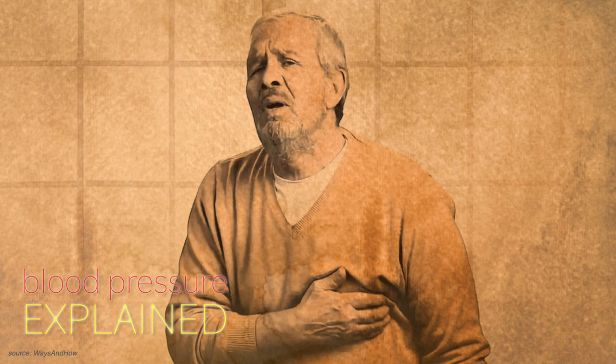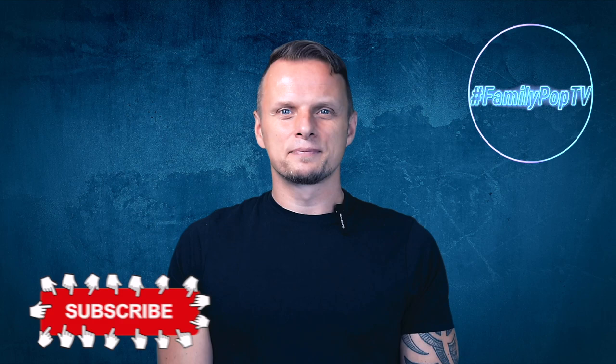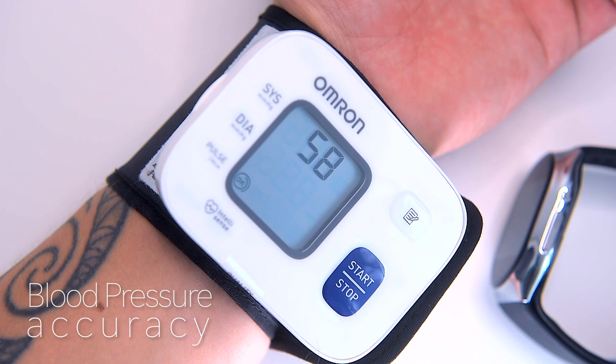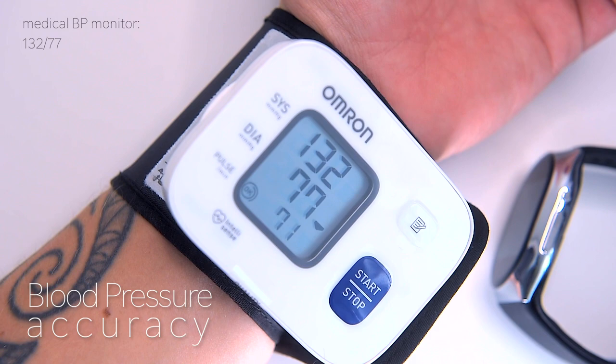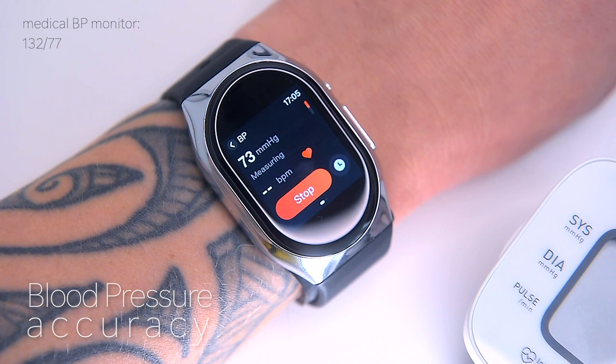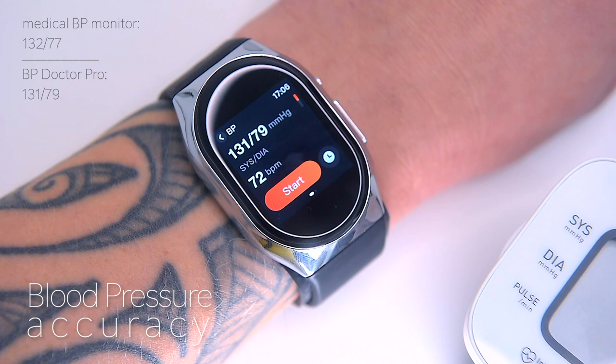Let's compare the readings from the watch against the OMRON blood pressure monitor. For reference I'm using an OMRON blood pressure monitor. During measurements I got my arm supported so my elbow is about heart level — obviously the cuff should be placed on bare skin, not over a shirt. Here we got 132 systolic and 77 diastolic on the OMRON. Now measuring with the BP Doctor Pro — normal blood pressure for most adults is defined as systolic less than 120 and diastolic less than 80. The reading is 131 by 79 mmHg — we got almost identical readings.